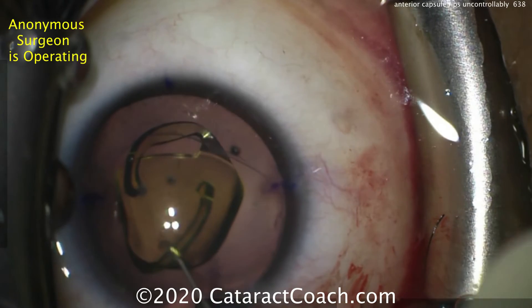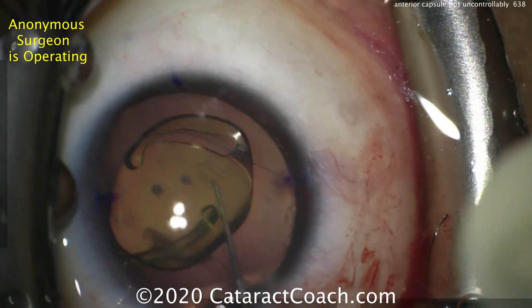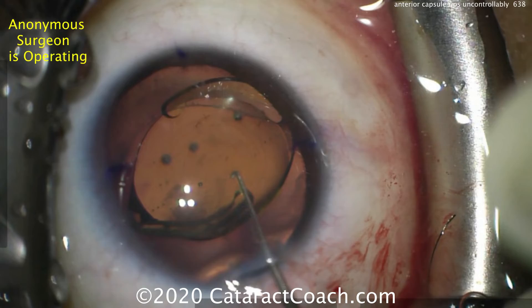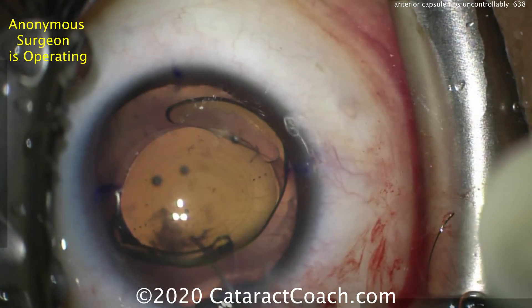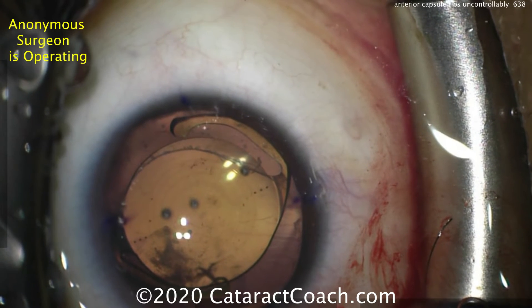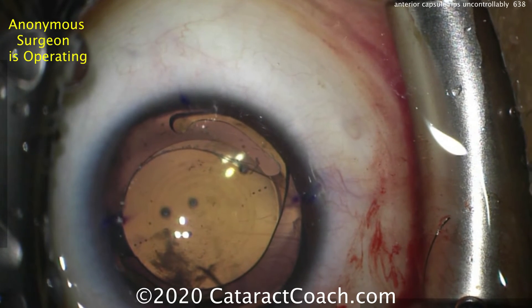Putting it around here, you can see it's also a relatively large eye — the eye well looks small. This patient is probably very myopic and has a large anterior segment size. You can't always predict when things are going to go south, when you'll get a complication. You've got to be able to just roll with it and recover from it. Everyone's going to fumble the ball at some point — the main question is, do you recover the ball? And this is a good example where everything was recovered.